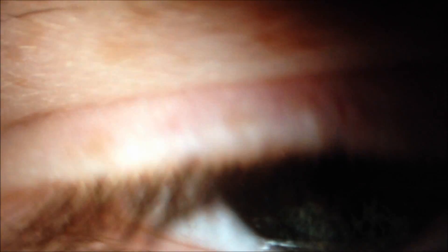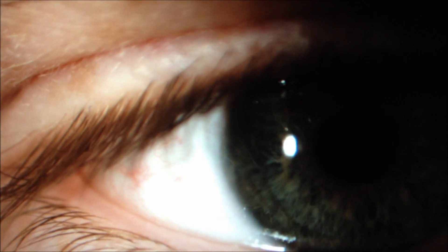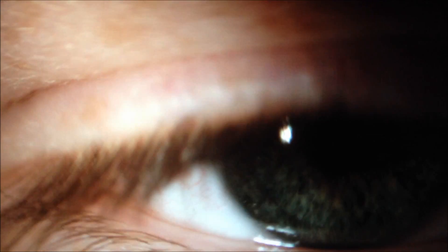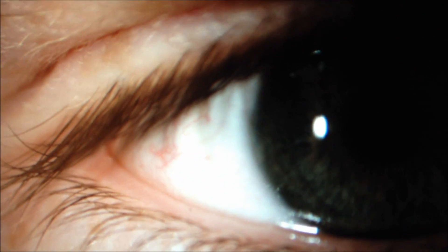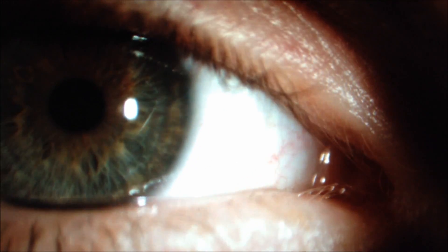So here we have a slit lamp view just of the external eye. We're going to look at the bulbar redness, the limbal redness, and the limbal vascularization. The first thing we want to do is just have a general sweep just across the front surface of the eye just to see how it's looking. If we have a sweep across here, you'll be able to see that it's looking alright.